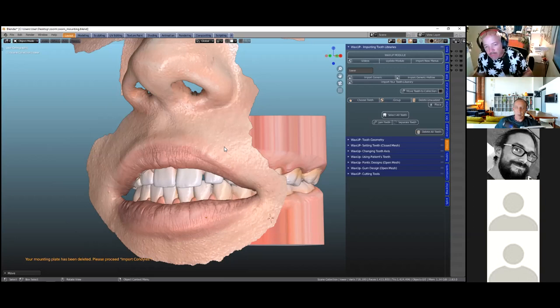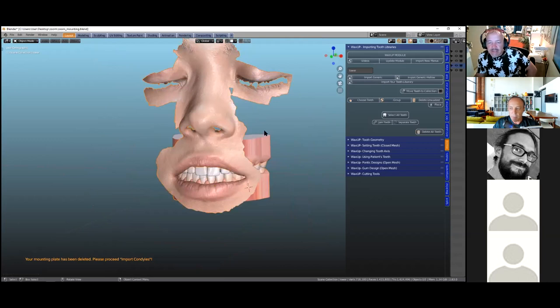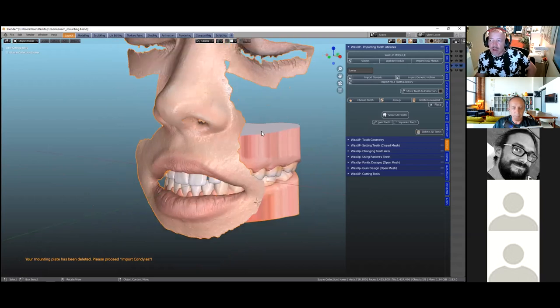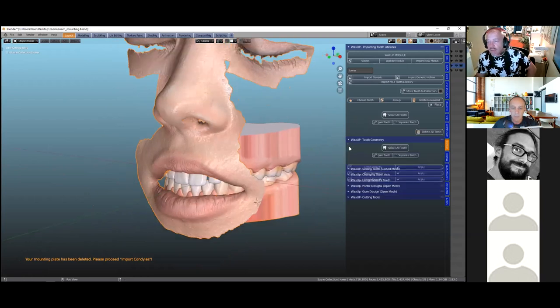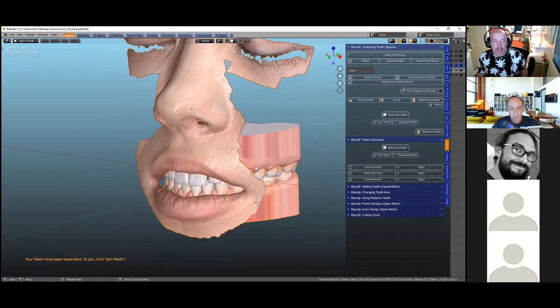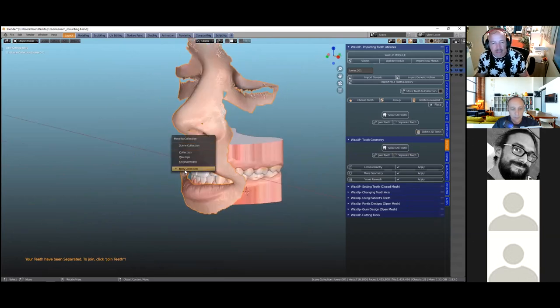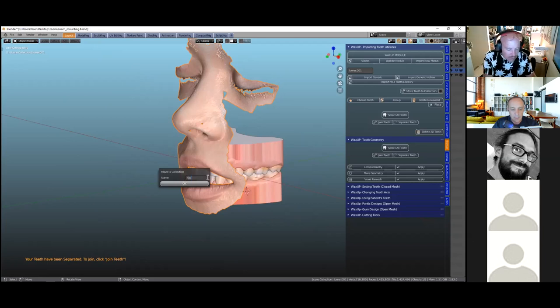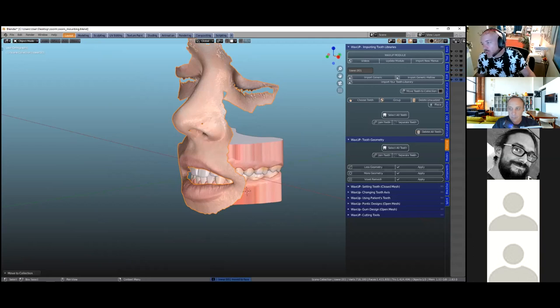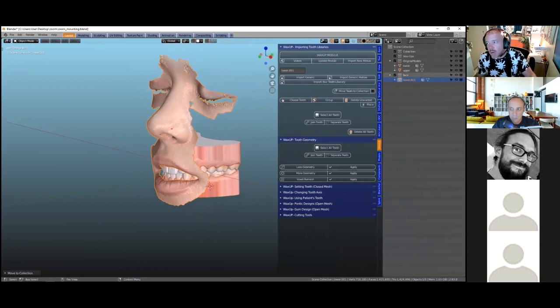We're going to import a generic set of teeth. The face scan itself we can remove from the model now — we don't need it anymore. Throughout the module you'll see the 'separate' button which separates one object from another. I'll take this facial scan and move it using the M key into a collection. Object management is one of the most important things in all our modules — sometimes you may have 60 or 100 models on the scene.